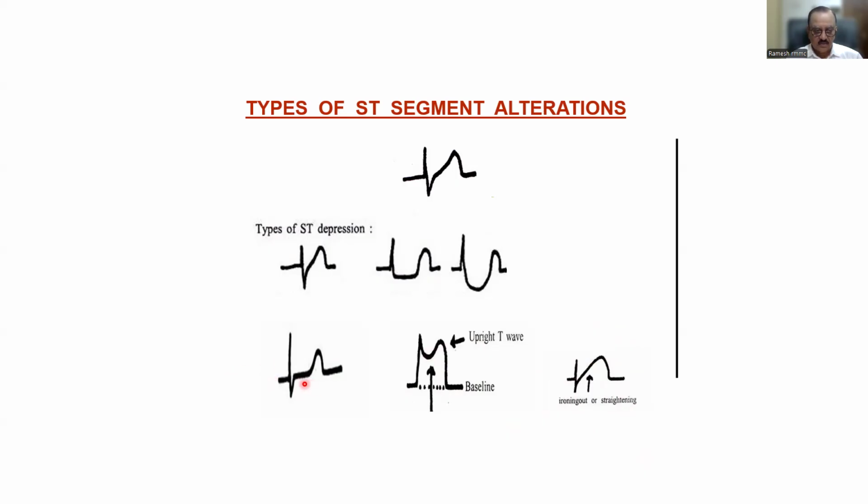See this ST segment. Do you think this is normal or abnormal? Normal. Unfortunately, there is no graph here, but see this pattern. Here also concavity is lost. Not more than 2 squares. Concavity is there. This concavity is there. What is that? It is horizontal. It is staying in the midline for a significant distance. If you have the ECG paper there, maybe it is 4 to 5 small squares.